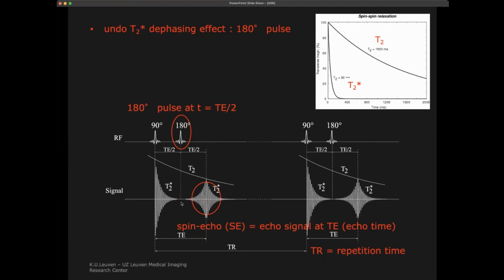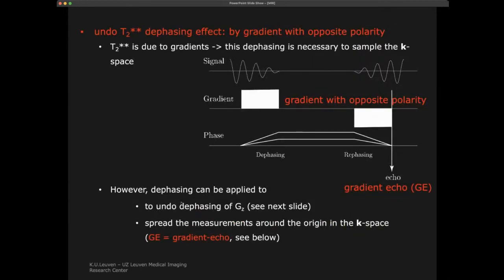So this is another pulse sequence that actually improves the image, because it takes away many of the inhomogeneities that are not working well. Now, the fact that we put on gradients, which I told you before is putting on a gradient in order to do the X phase encoding, and then putting on a gradient to do the Y frequency encoding, actually induces a dephasing also. So we very deliberately add a dephasing. But this is again a dephasing that we can compensate.